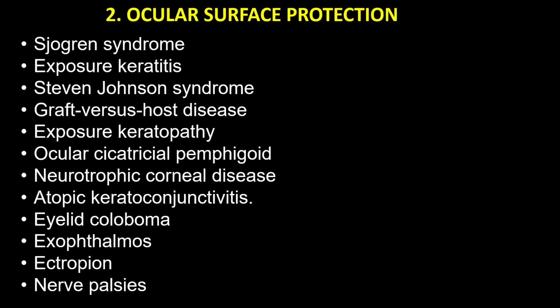So I've mentioned most of these ones, and I don't think I have to bore you further with that. So anything that compromises the corneal integrity, that will expose the cornea to dryness or desiccation, will likely benefit from having scleral contact lenses on.